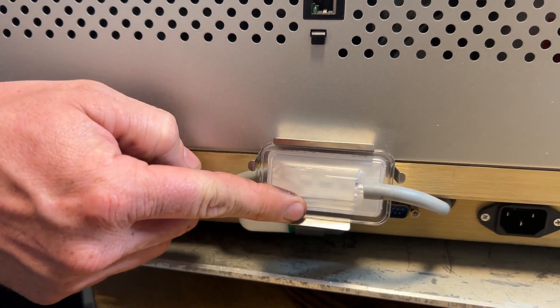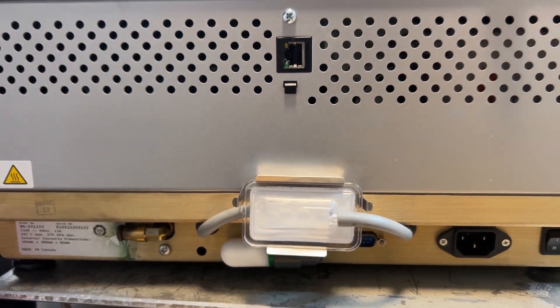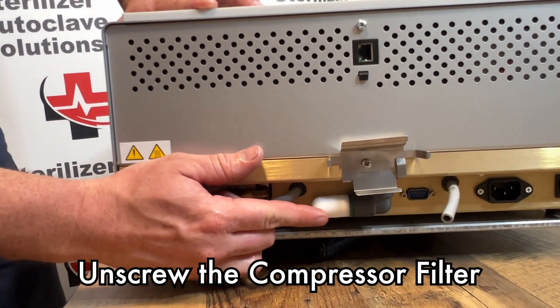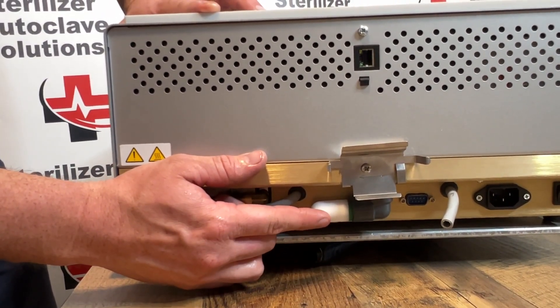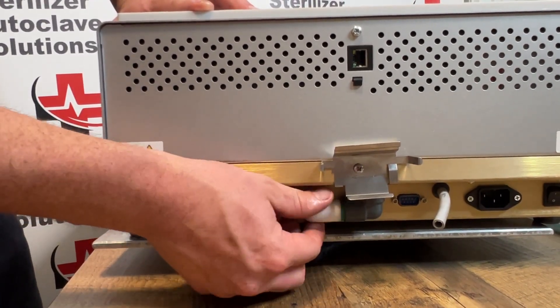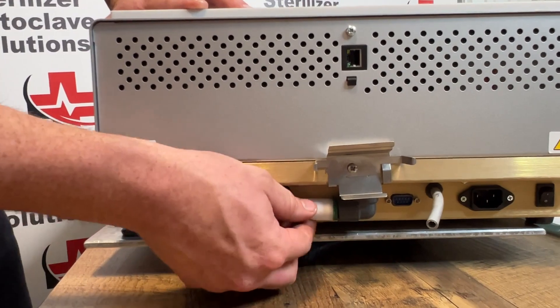We are going to remove your compressor filter. Not all STATUMs have a compressor filter. If you do, it will be located directly underneath your biofilter. This will simply just unscrew.